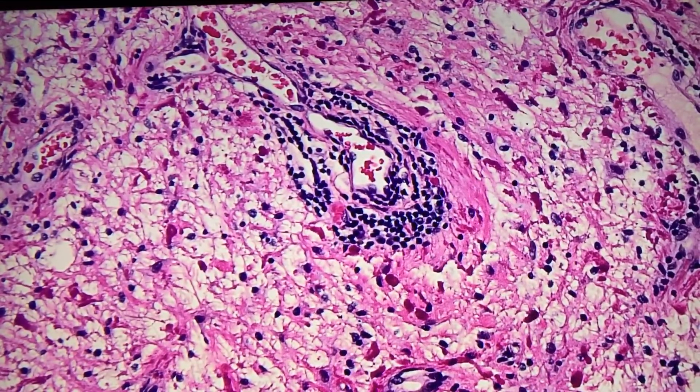So there's a perivascular chronic inflammatory infiltrate. But not malignant, like in the last case. Clearly these are small mature lymphocytes.